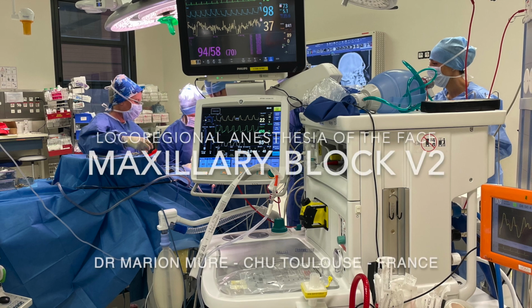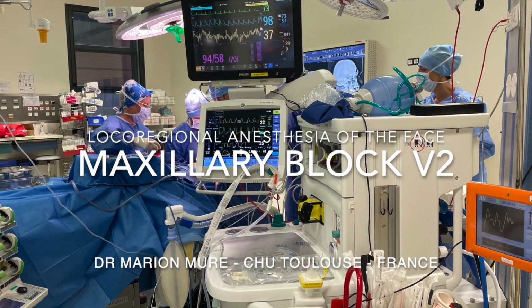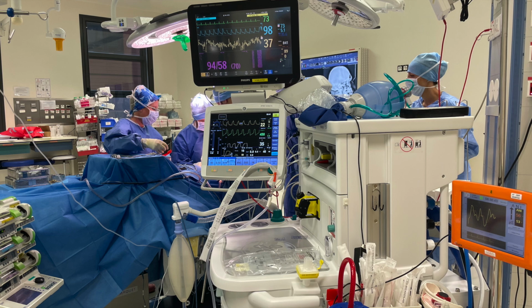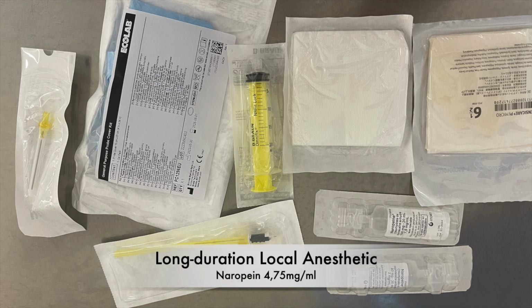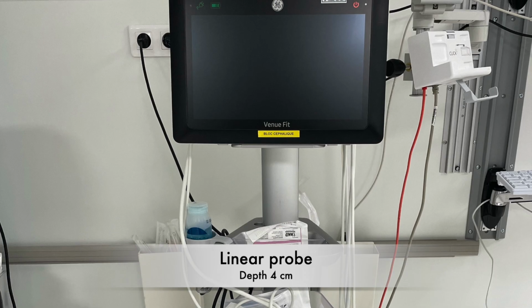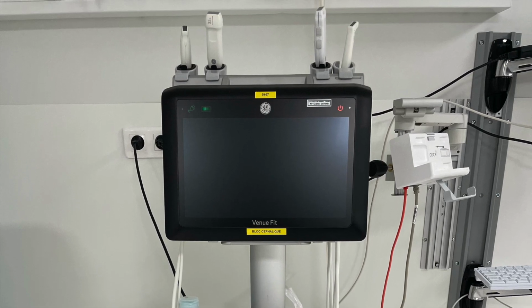In fascial LRA, locoregional anesthesia techniques, the maxillary block involves targeting the V2, the second branch of the trigeminal nerve. For this procedure, a 50 mm echogenic needle and a long-acting local anesthetic, such as ropivacaine, potentiated by intravenous dexamethasone, are used. A linear probe with a depth setting of 4 cm is also employed.